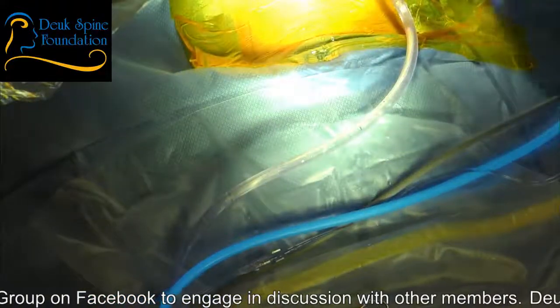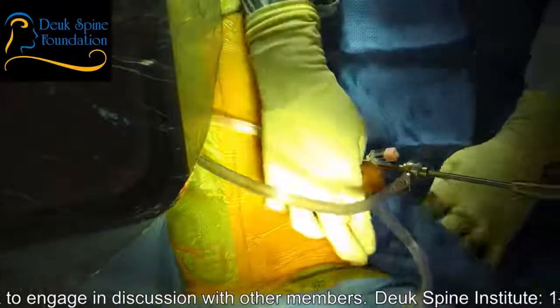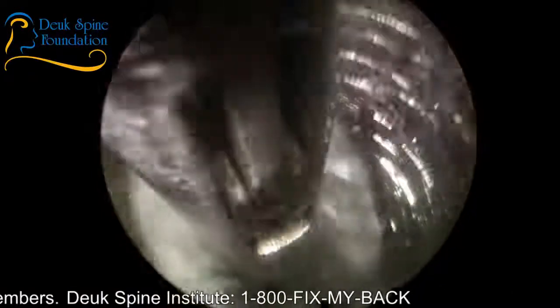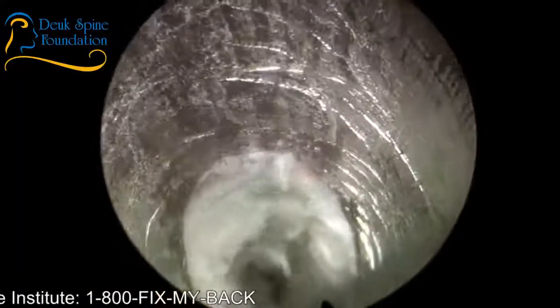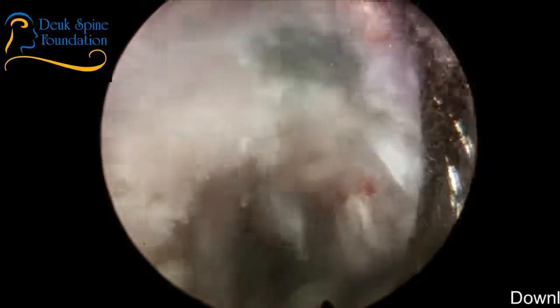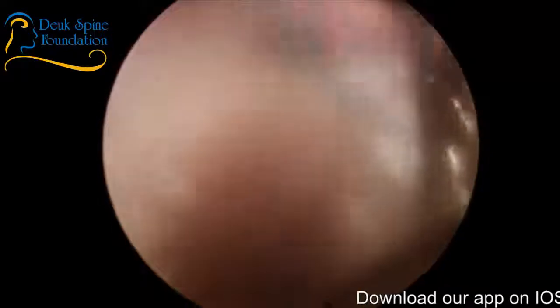Okay. So look at this beautiful surgery. No bone removed, no laminectomy, no foraminotomy. I mean, no weakening his spine any more than the other surgeons have already weakened it with their other surgeries that he's had. It's just so elegant. Such an elegant procedure. Laser, I can get a little bit more of that. And this is taking longer than normal. Why? Because this patient's had a very scarred in disc herniation, number one. Number two, it's very big. This is a lot bigger than the ones we did earlier today.